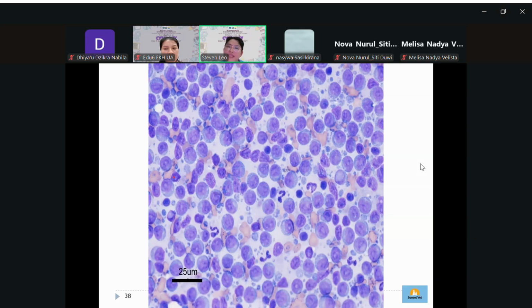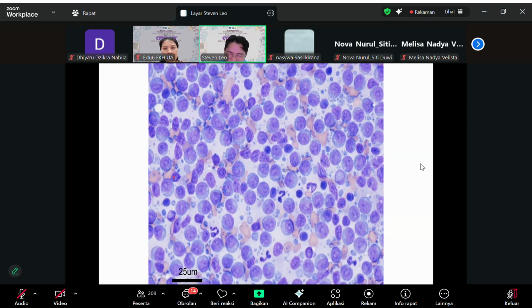Then it means neoplastic cells, so what do you need to think about? Right now you have to think about either epithelial, mesenchymal, or round cell. So which one of these? It's good. It's not inflammation, it's more neoplastic or cancer. Okay, good, round. Good answer.